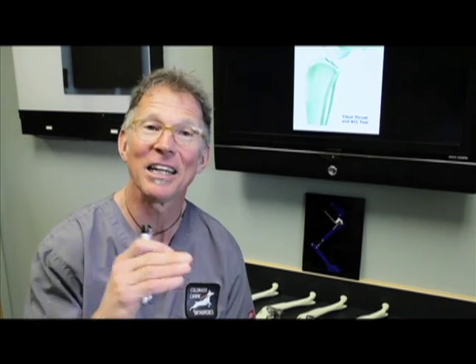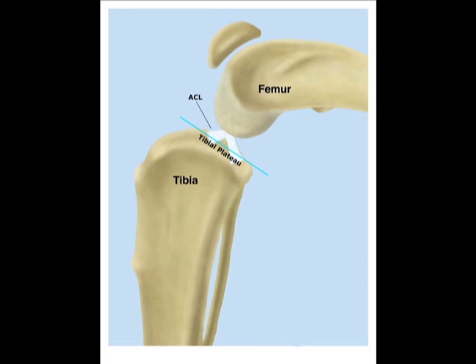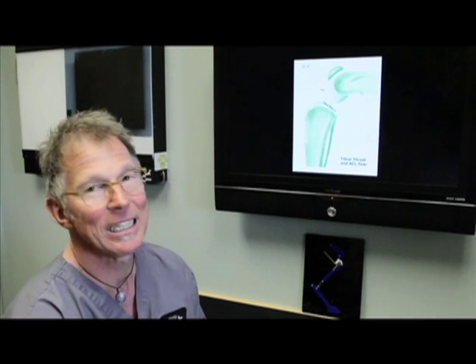And if you've watched the previous ACL discussion here on our website, you might find a little of this redundant, but we're going to start with anatomy. An anatomic illustration is here on the computer screen, and we see the femur above the joint, the tibia below the joint, the ACL connecting the two bones, and the top of the tibia is the tibial plateau. That sloping tibial plateau is a key anatomic point of why we think the TPLO makes the most sense for ACL repairs.